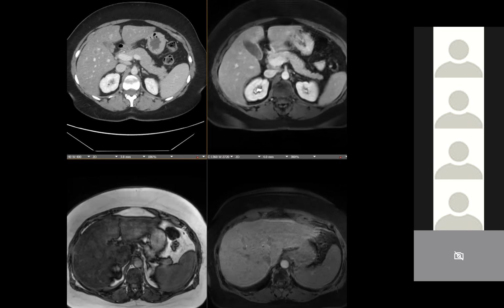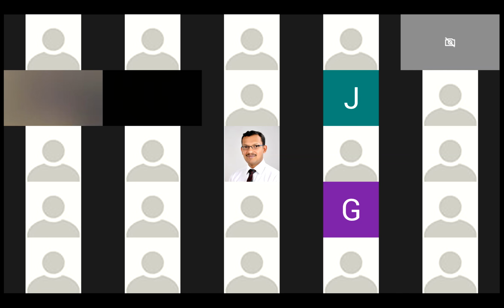And yeah, a lot of people are using it now also for melanoma, like the high-risk melanomas, because they think they can pick up more lesions on the Eovist hepatobiliary phase. Steve says, yes, some anti-neoplastics cause fatty liver too, which definitely, especially in patients on chemo for breast cancer, they're going to get a lot of fatty liver.